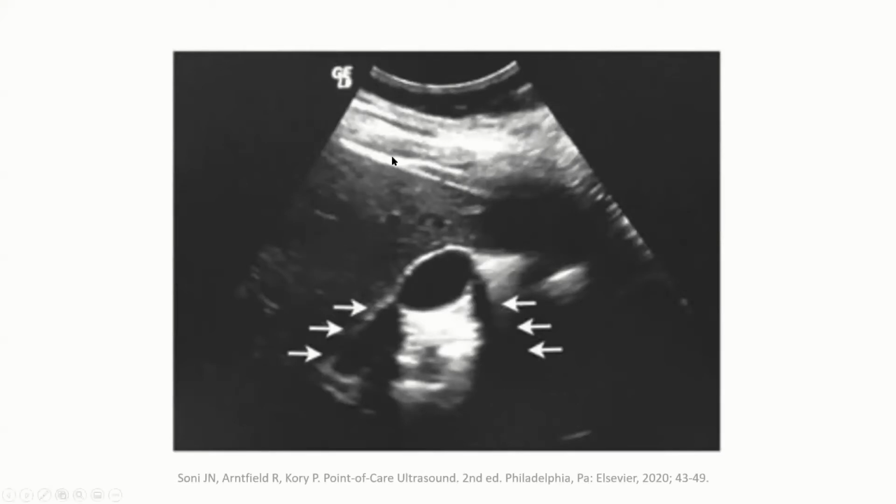So here, this is liver, and this is gallbladder. And then we can see this dark straight line here. So this is gallbladder. Is that due to artifact or is that due to acoustic shadowing? It's important to distinguish.